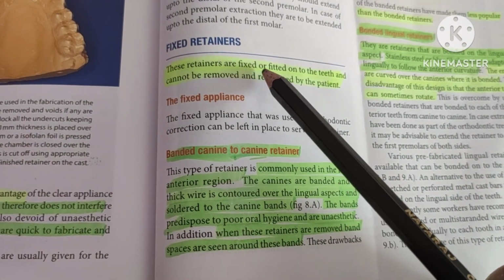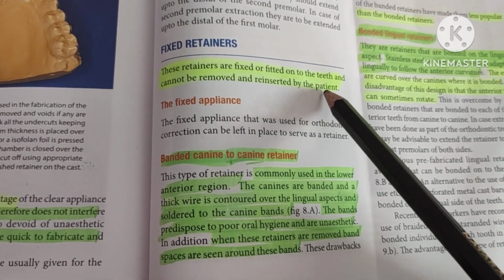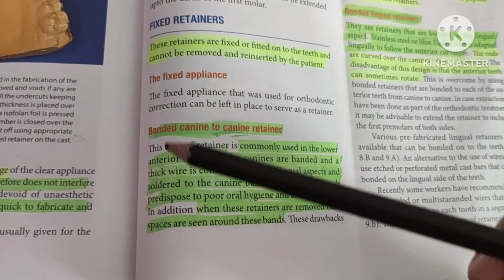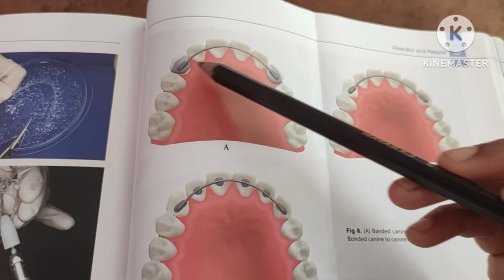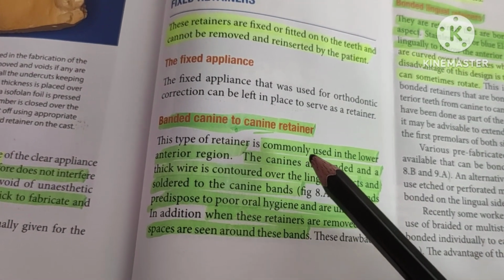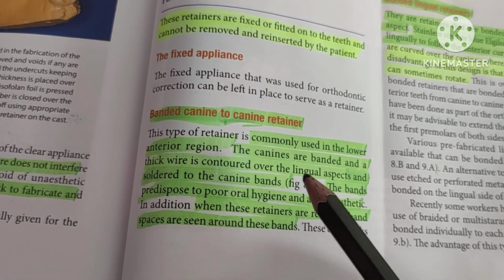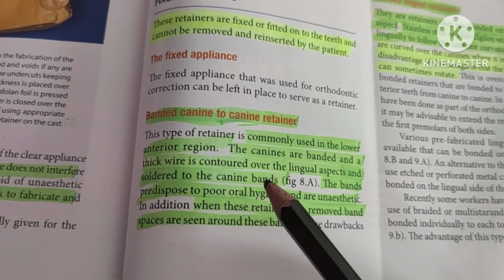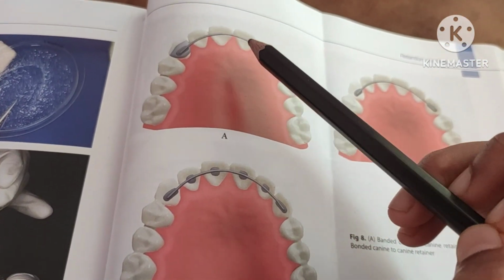These retainers are fixed or fitted onto the teeth and cannot be removed and reinserted by the patient. Now the fixed retainers are banded canine to canine retainers. So this is the picture of banded canine to canine retainers. This type of retainer is commonly used in the lower anterior region. The canines are banded and a thick wire is contoured over the lingual aspect and soldered at the canine bands. Here, the canine is banded and the lingual wire is here.